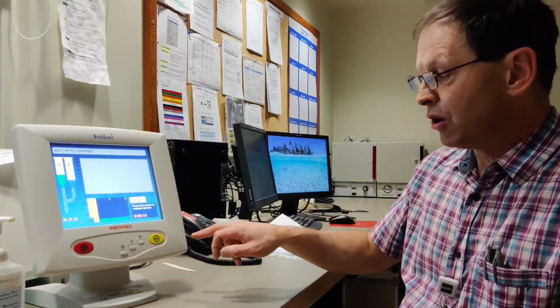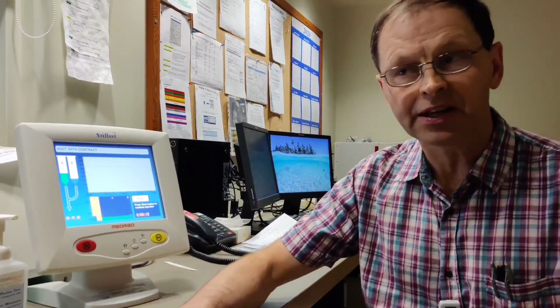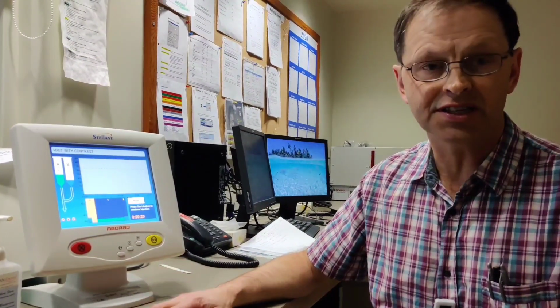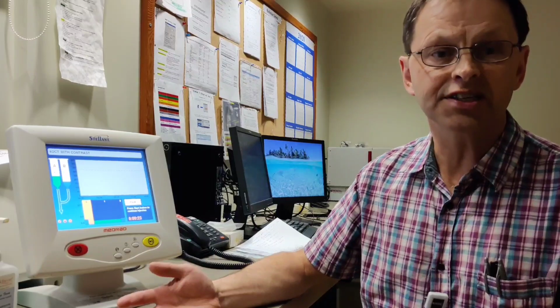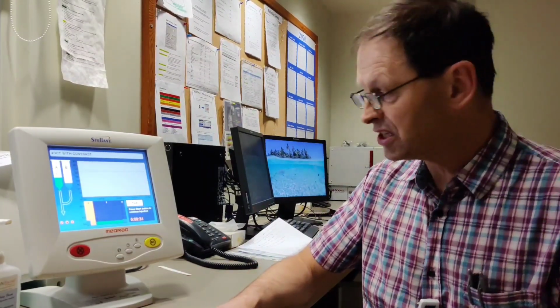The system goes into a hold, and it'll just keep counting up. At this point, this is where you can complete all the rest of your planning of your CT scan. For a 4D CT scan, you would need to delineate the length of the scan and your FOV and all the other parameters, make sure that your slice number is reasonable.